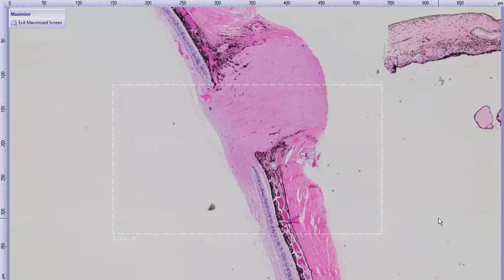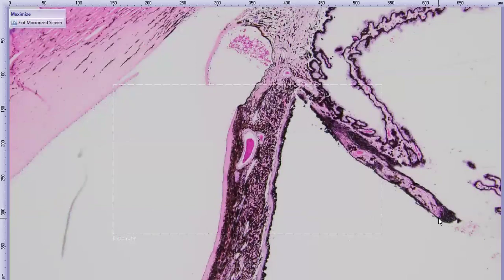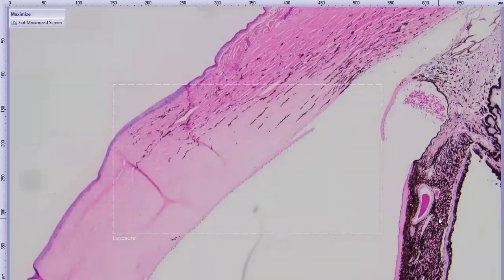As we move back here, the retina and the optic nerve look normal. So there is no evidence of glaucoma histologically, and they did not report glaucoma. So let's go ahead and get a little bit higher mag here. So just going to show you.